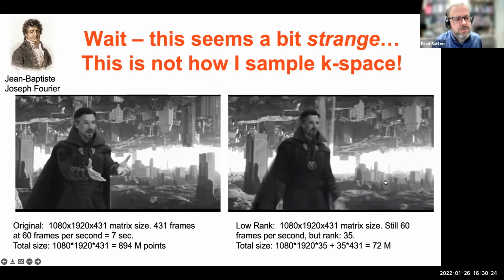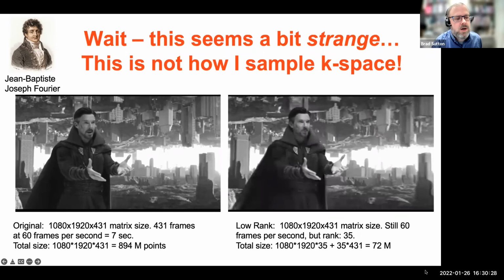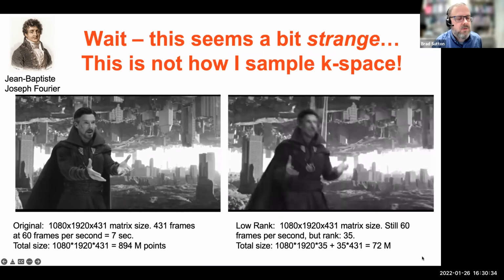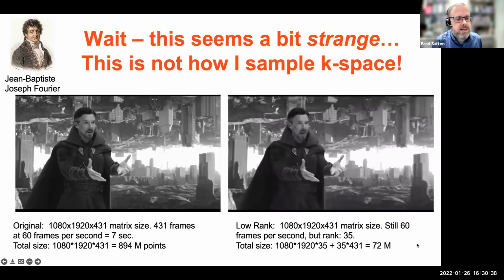And you're going to see that despite this being a very complicated scene, this has got to be a worst case scenario, we are capturing a lot of the dynamic motion here. I'm going to play it again in this scene. And so this is really representative of what we're doing in our acquisition then. Okay, so a reduction factor of 12 in the storage here, which is more than an order of magnitude.